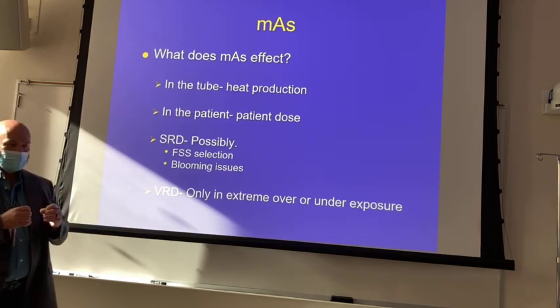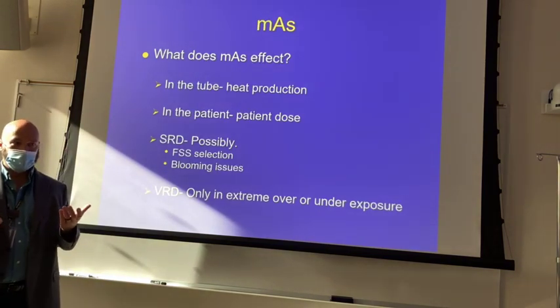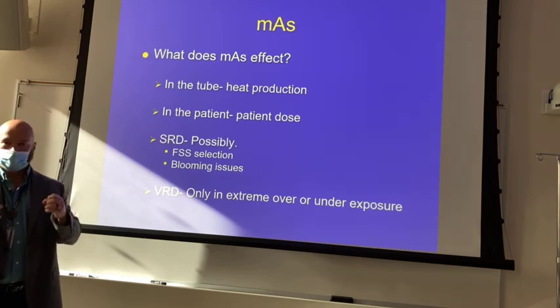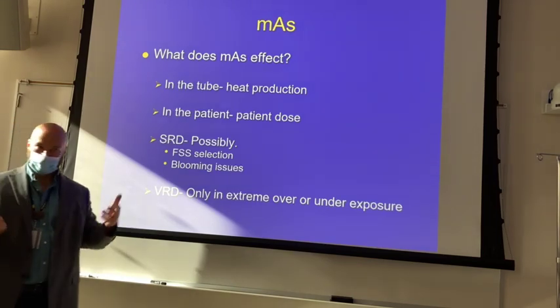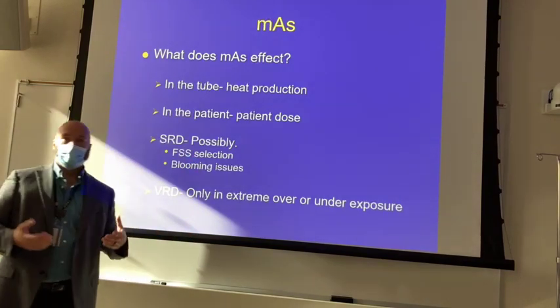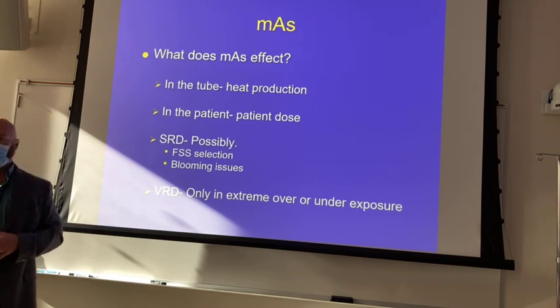So if you have a different amount of balls in each one of those cups, you get contrast, right? So you've got them filled up to different levels, you've got different levels of contrast, and you can actually make a distinction between different tissue types. But what if you filled every one of them up all the way to the top? Couldn't tell. They'd all be the same, right?